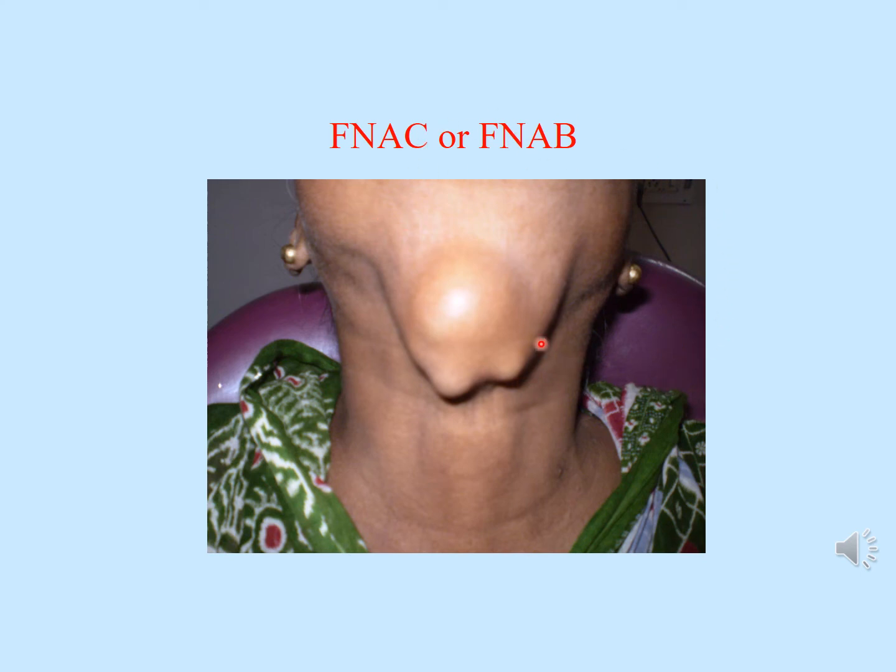So here you can see that there is a swelling here on the neck, a very localized, well-defined swelling. And in these cases, when you want to identify or come up with a diagnosis, what you can do is a procedure called fine needle aspiration cytology, or FNAC.